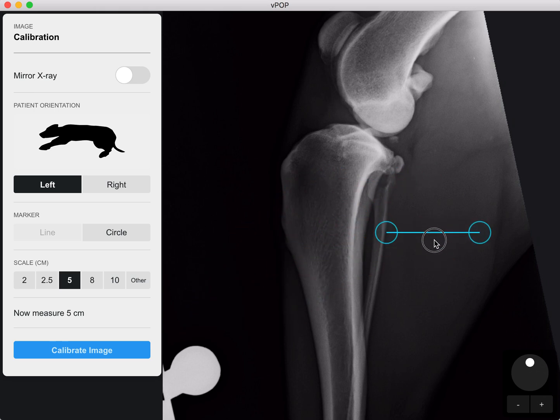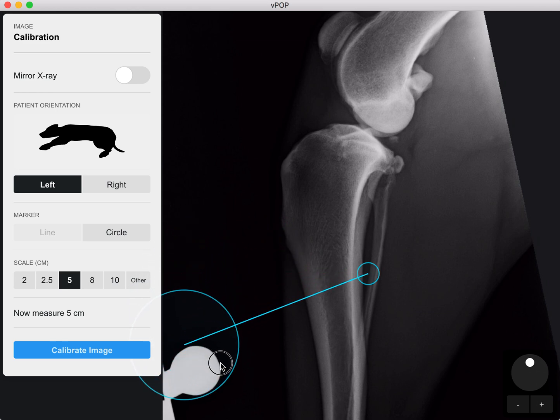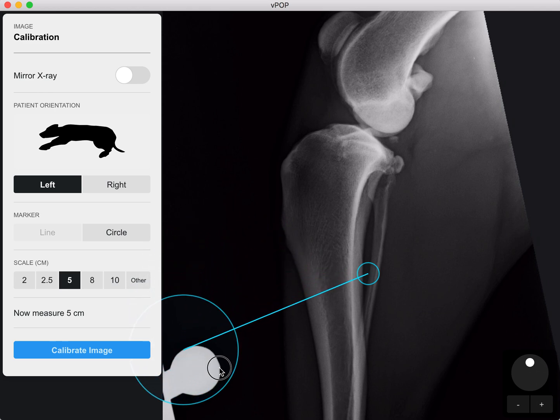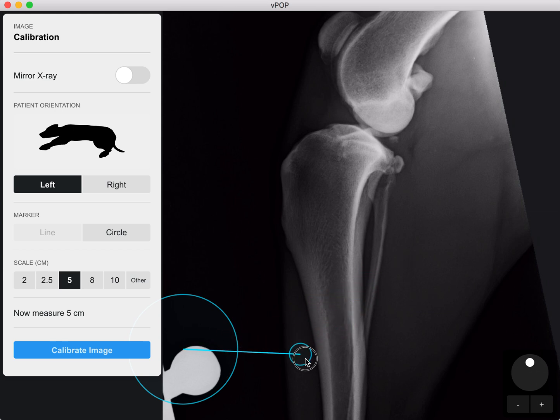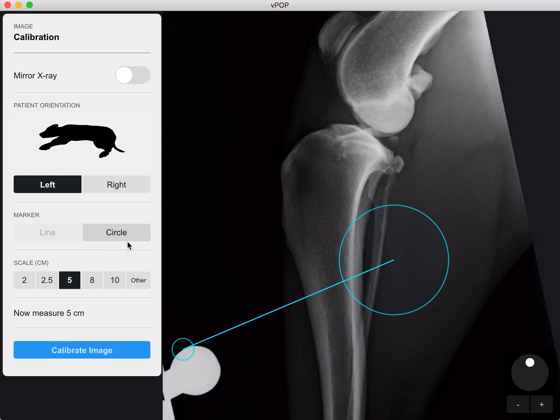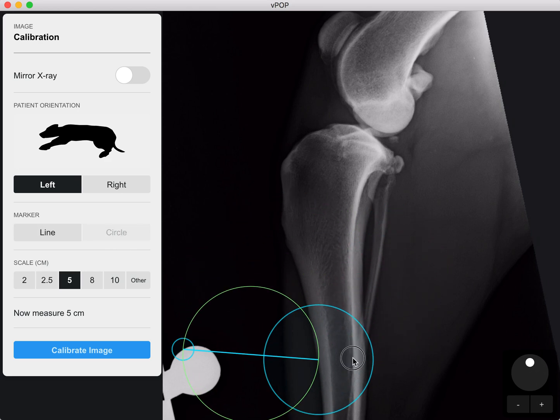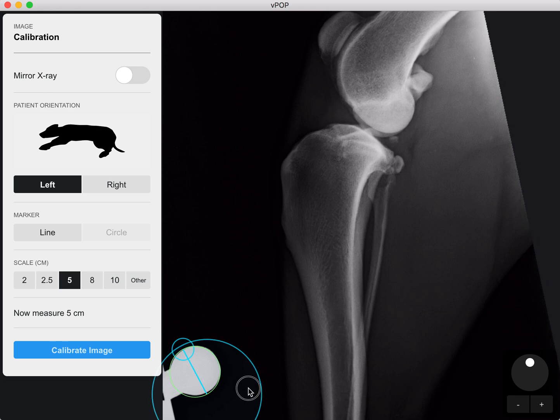We can move it parallel around the screen, or we can click on either end and it goes into precision mode. You can move that around to one end of your marker and then to the opposite side. Or indeed you can use the circle tool as part of the calibration process by clicking here and swing that in to complete and overlap your circular radiographic marker.